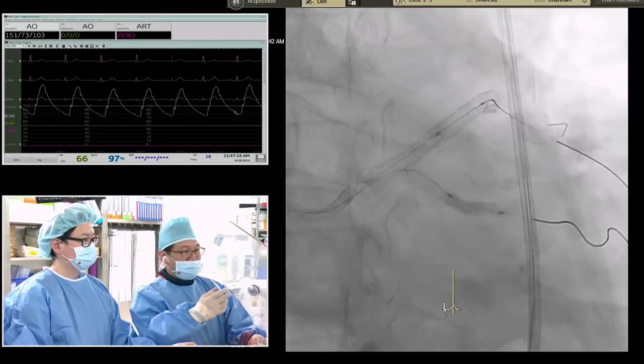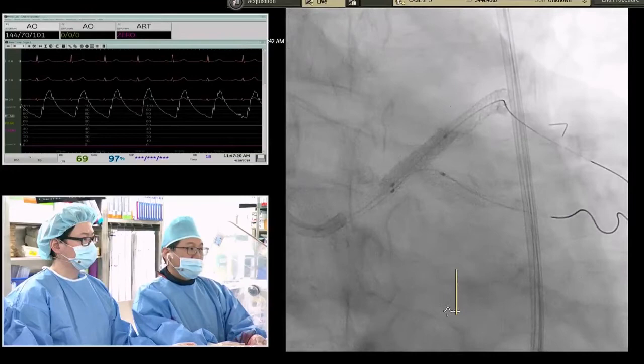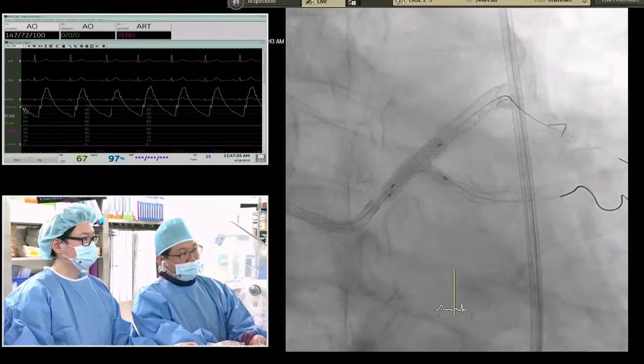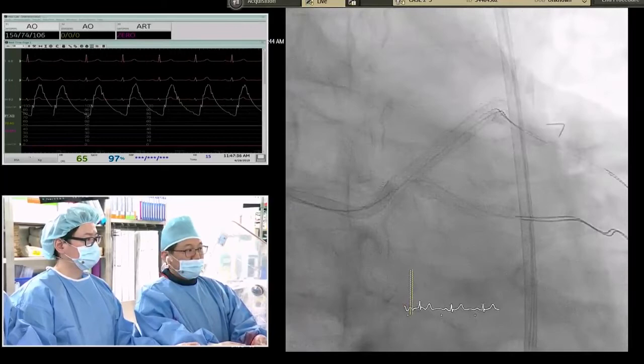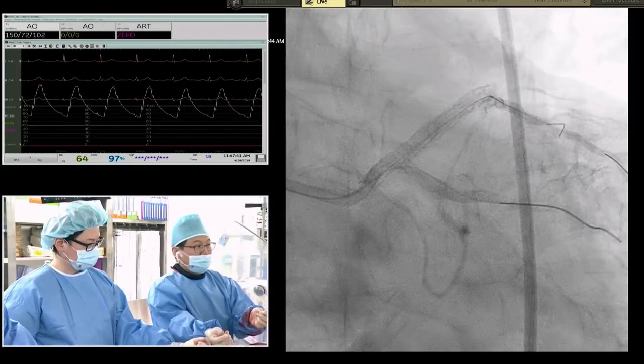Left main, sequential high pressure. This is the final kissing. The left main is very big, so I pulled a little bit more and inflated to 12. This is almost the final, just before the IVUS evaluation.